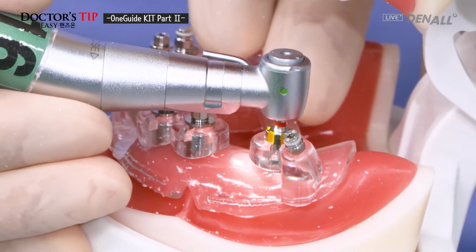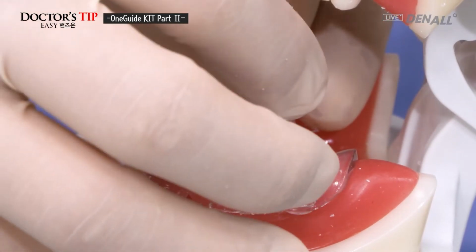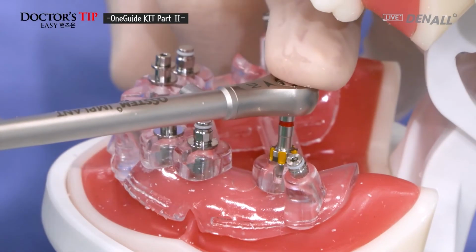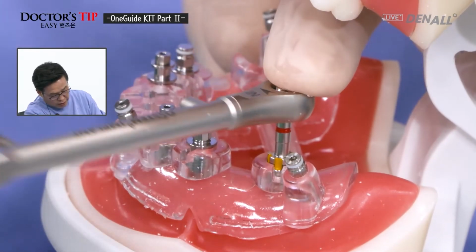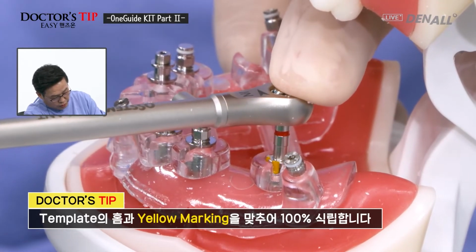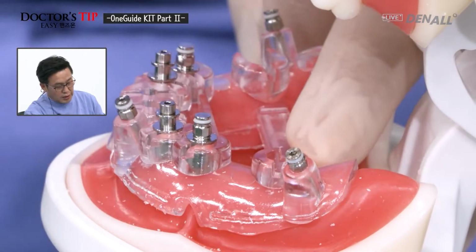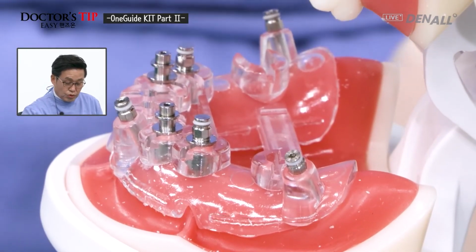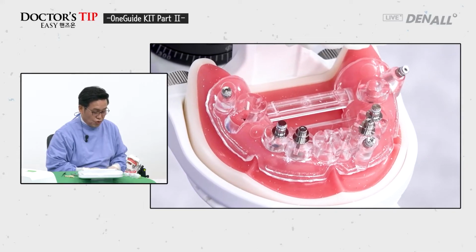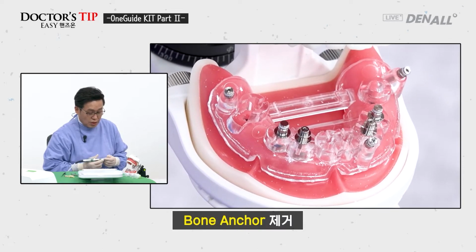With engine, connect approximately 80% and then connect the wide type fixture driver, and then as shown, do depth control as well as hex control. On both sides, you check whether it fits well, and then it's done. So 6 on both sides, it's complete. And number 4, 34 and 44, vertical anchors will be removed.